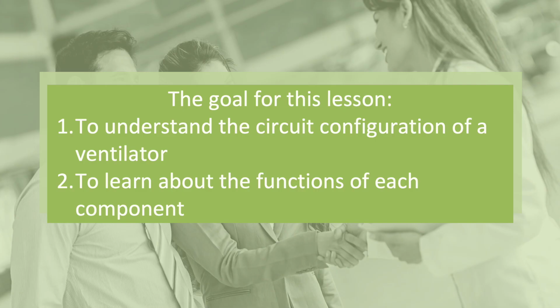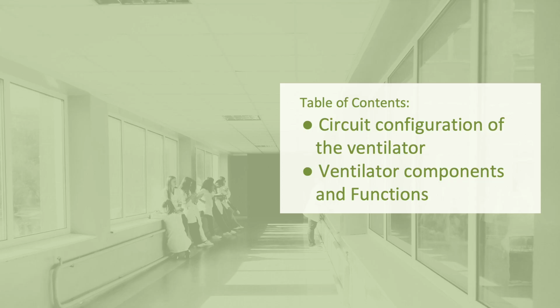The goal for this lesson is to understand the circuit configuration of a ventilator, and learn about the functions of each component of the ventilator. This is the content of this lesson.